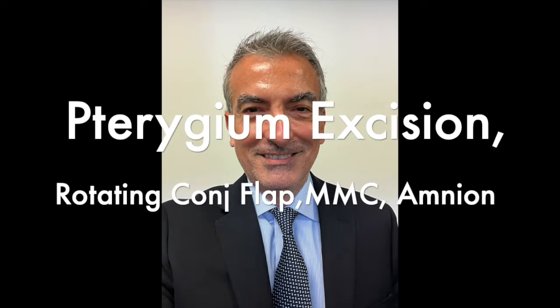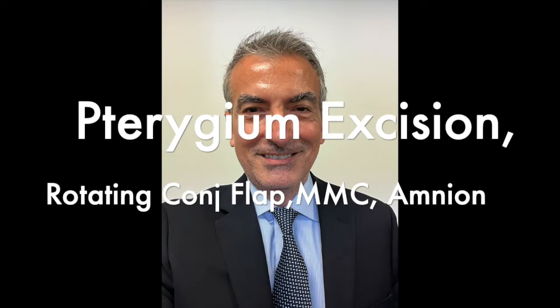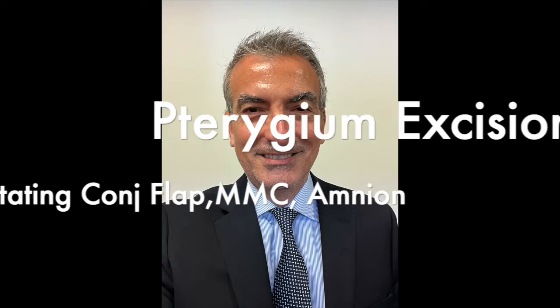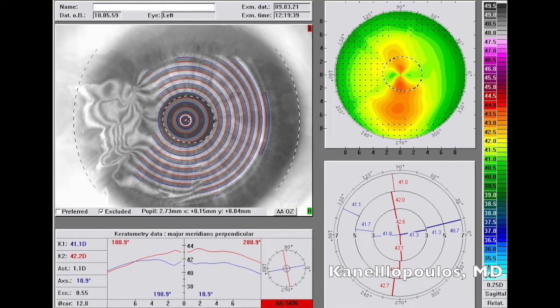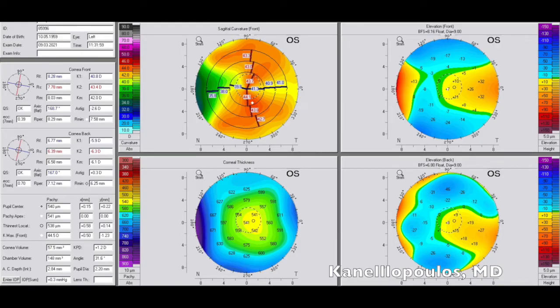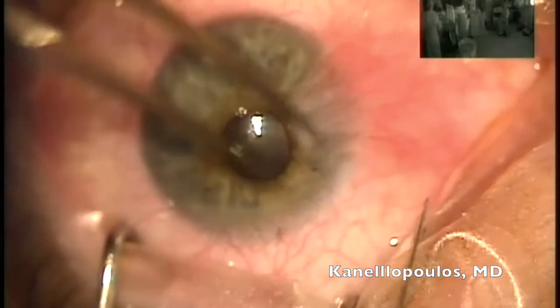We're going to talk about a very familiar problem for ophthalmologists: pterygium. Its excision dates back to the years of Hippocrates in ancient Greece. We're seeing a gentleman here in his early 60s with very severe pterygium; it's very irritating. We can see how it distorts the placido rings in his topography of the left eye, maybe contributing some of the with-the-rule astigmatism. Similar images on the Scheimpflug tomography, the Pentacam, showing the significant irregularity that it causes nasally.